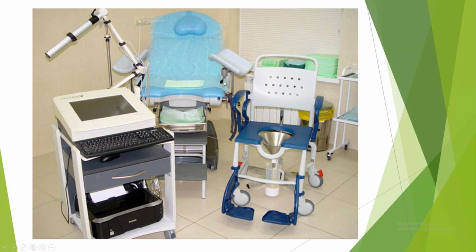After the uroflowmetry, the patient will be seated on this chair, and the catheters will be connected, and the monitor will record all the readings. So this is the machine. These are the settings for this urodynamics.